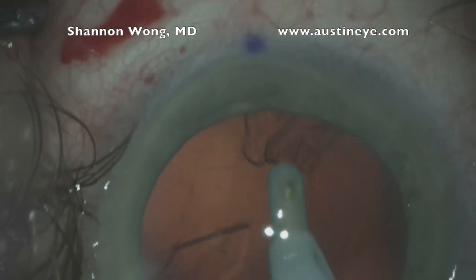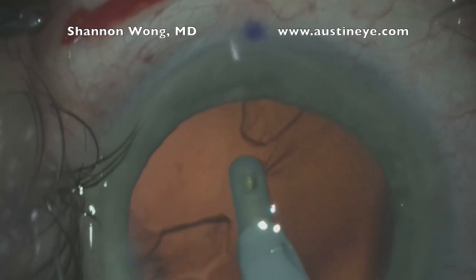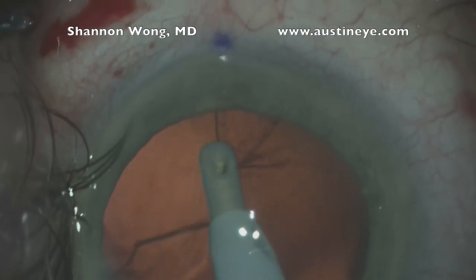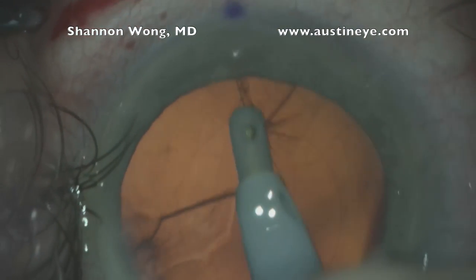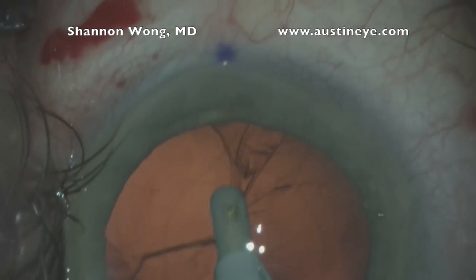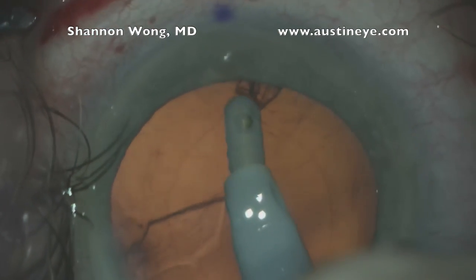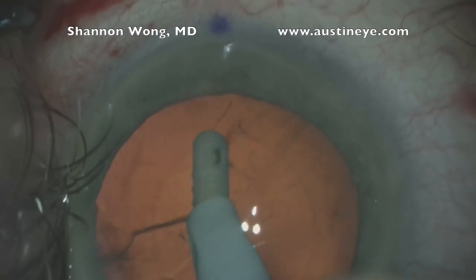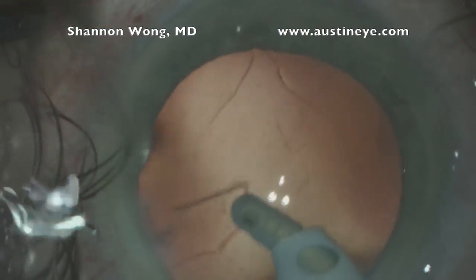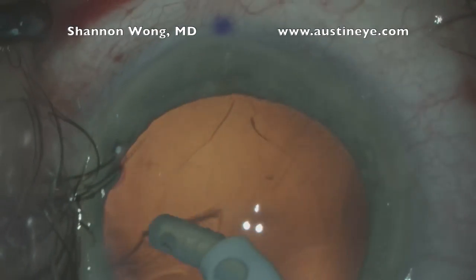We're using a Zeiss Lumira T microscope which gives outstanding visualization of the capsule and any cortical fibers that remain, so we're able to be very thorough in removing any cortical remnants.